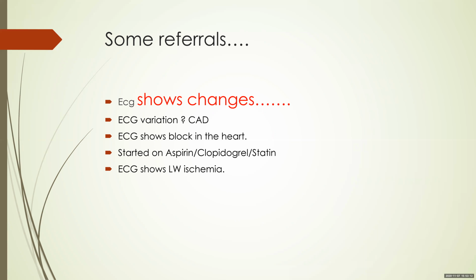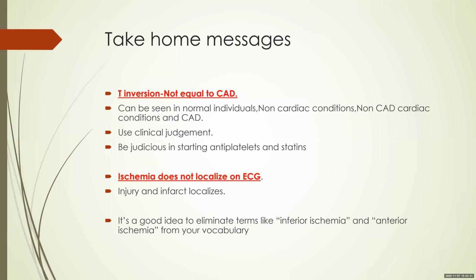If they are a manual laborer, they generally stop their activities. It proves a burden for their livelihood. So I'm not saying don't start. I'm saying be judicious in starting, use your judgment. And if you are unable to do so, you send them to a higher specialist. "ECG shows lateral wall ischemia." Again, this is absolutely wrong. T-wave inversion or ST depression does not localize.